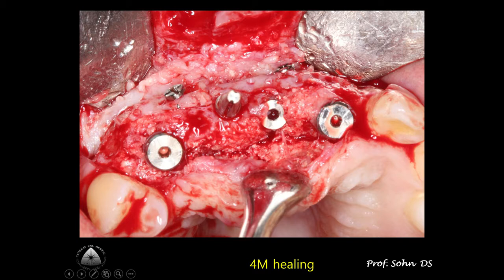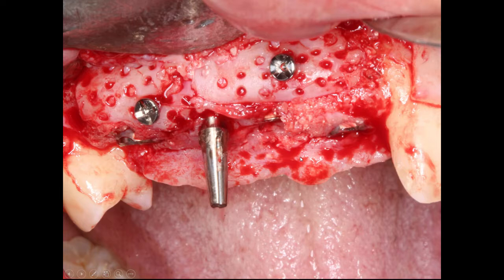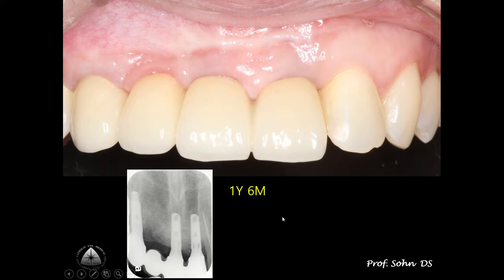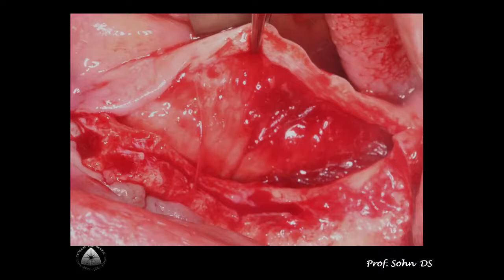After 4 months healing, occlusal view shows the well-incorporated tooth block bone and particulate bone integrated into the host bone. Temporary restoration using dental implants was placed, followed by final restoration. One year and six months follow-up results were favorable.